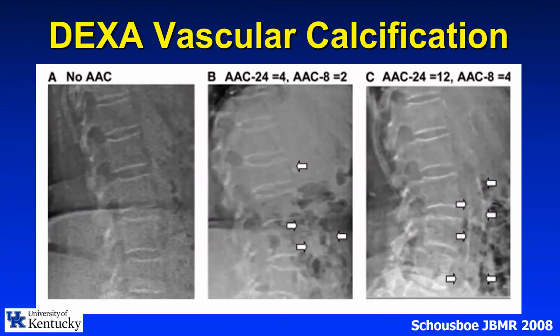And while you're doing that, you can also get some impression about the cardiovascular calcification, aortic calcification. Here, there are different scores. There is a score of 24 and a score of 8. For every single lumbar vertebra here, we have 1, 2, 3, 4, and each one has anterior and posterior. Then they calculate and give you a score.